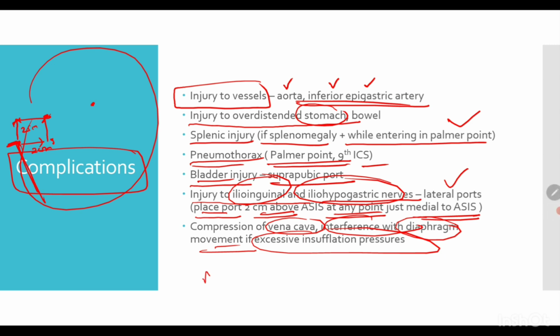How will you manage the complications? If you have entered, don't remove the needle first. Don't remove the needle. Explore the abdomen; immediately you have to explore it. Then call the concerned specialist.